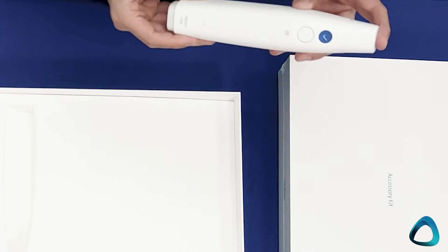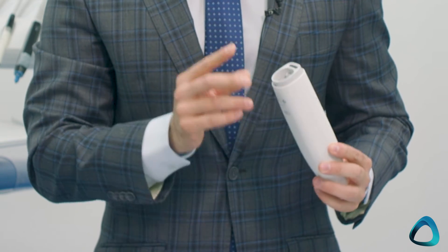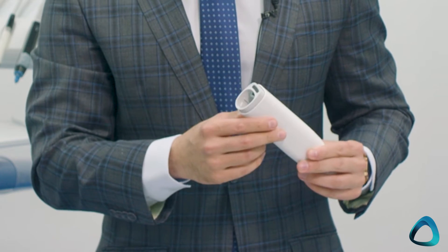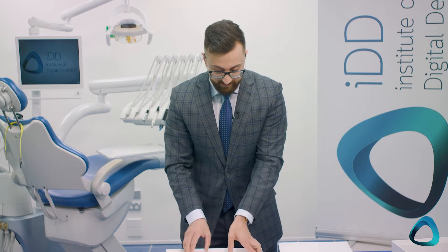When I take out the Medit i700 wireless, the first thing you notice is the back of the scanner — there's a big hole where the battery pack fits. This is different from the normal i700, which had the USB-C power delivery cable connection. That's where the battery pack goes. Now we need to go hunting for where the battery packs are.